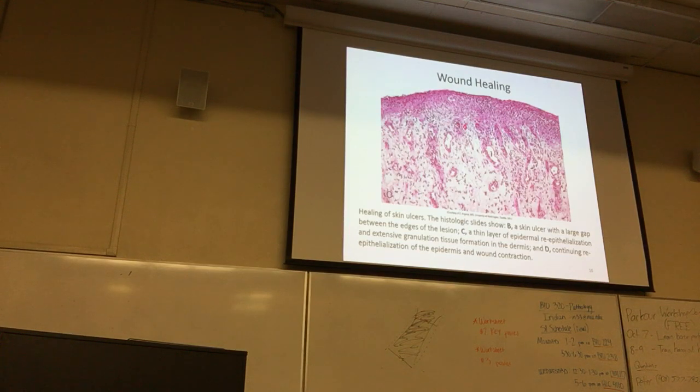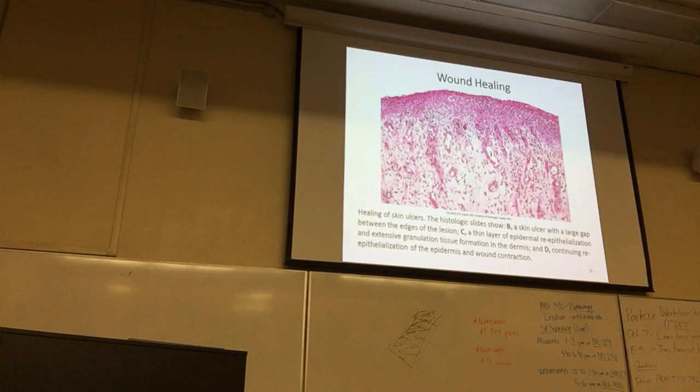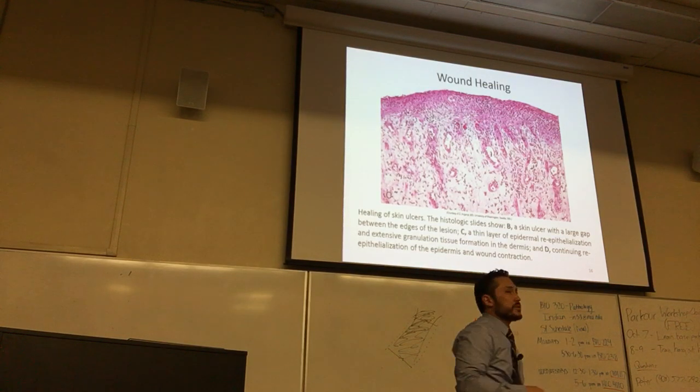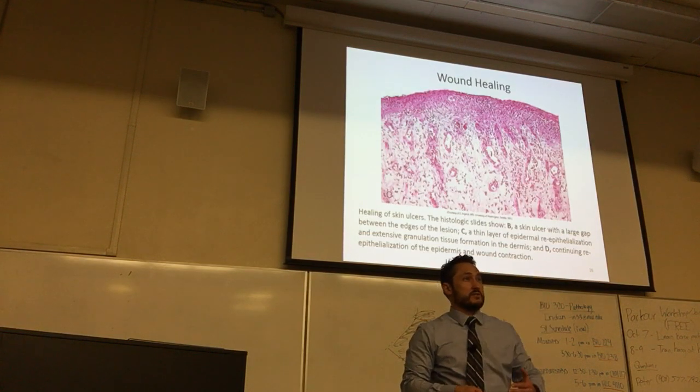Okay, so they're kind of like darker pink. Yeah. So those are not foreign body giant cells, but I can see why you would think they are. Those are areas where you've got collagen deposition attaching. Okay, so that was actually a good point out. If you were going to see foreign body giant cells in an area, you're going to see it in more than one location.